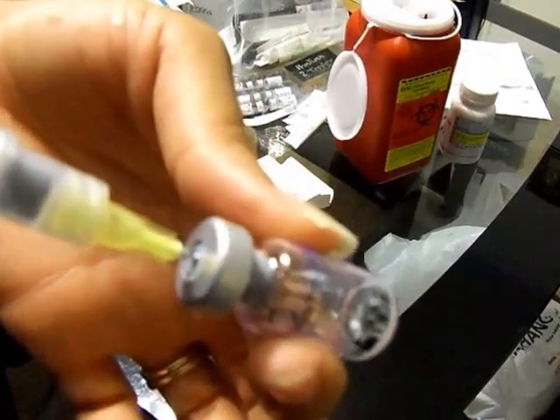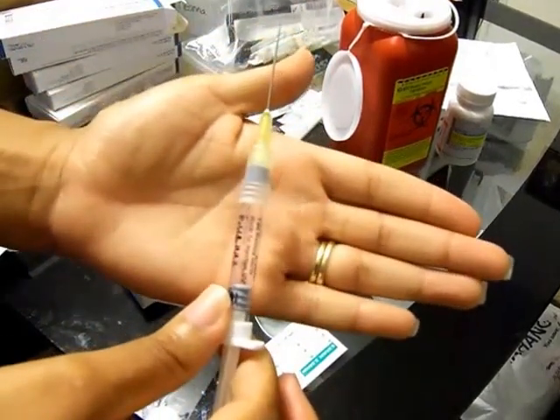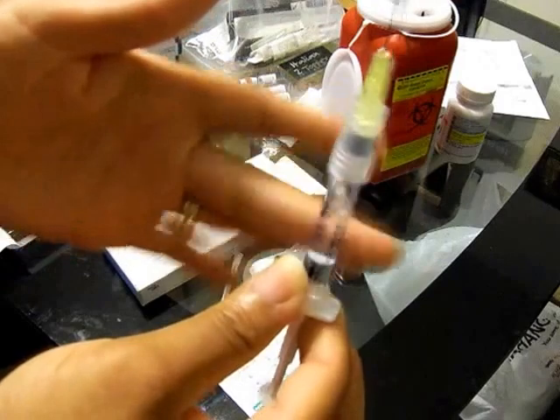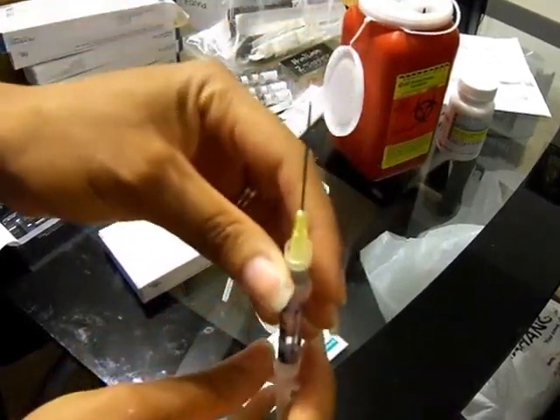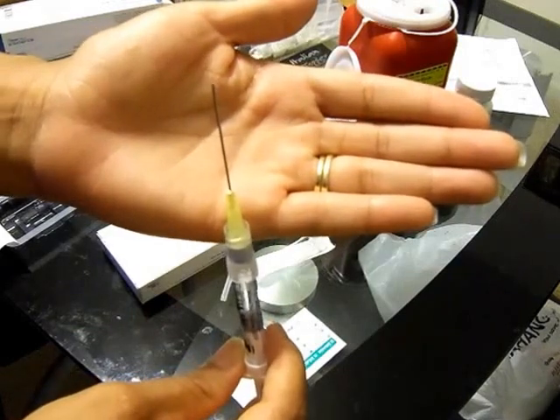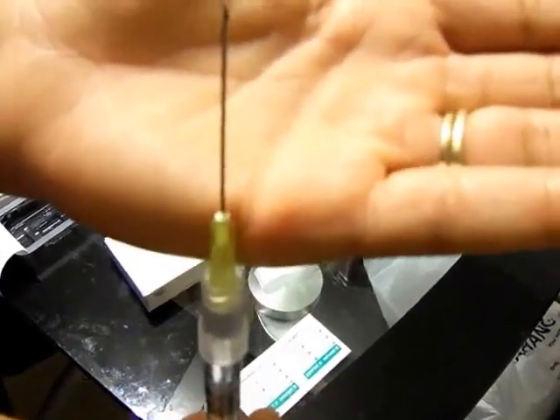Pull all the liquid out until there's nothing left, and you pull it straight out. Looks like that — you've got the liquid in it, and my liquid stops here. You've got air there, so I just shake it to get all the bubbles out. Then you take it like this and push it up until you get a drop, like that.